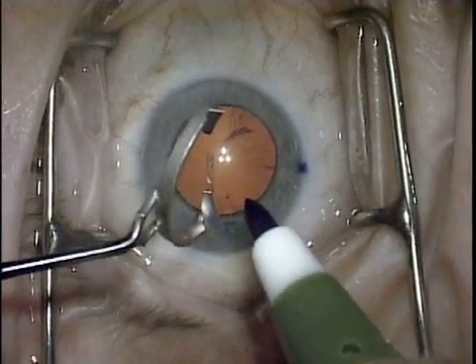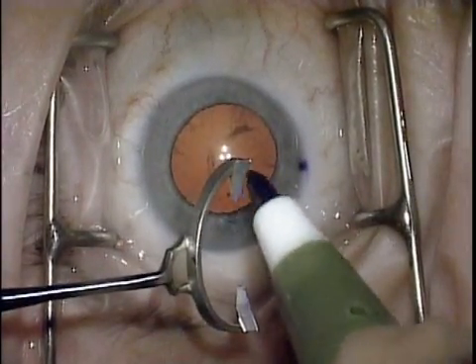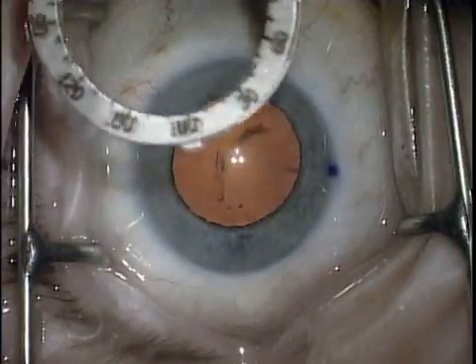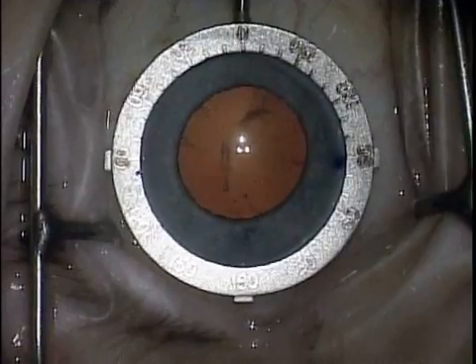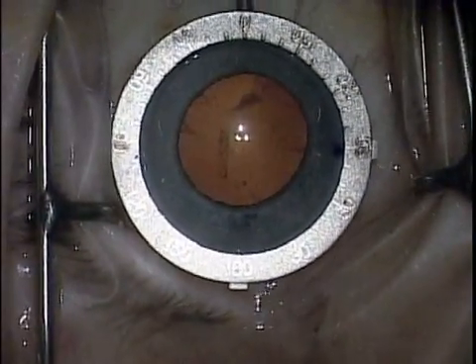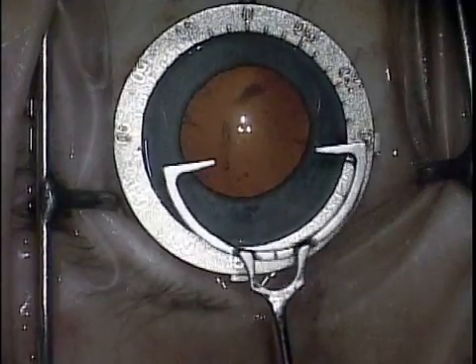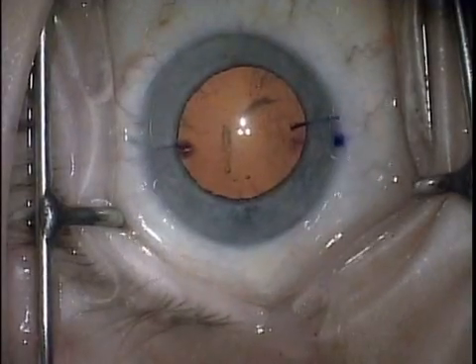In this first case, after inking the half-circle marker, the inferior axis bar is placed directly over the ink dots at 6 o'clock and the degree gauge is centered on the cornea. The half-circle marker is aligned on the indicated plus-cylinder axis and applied to the cornea to create ink marks at each end of a line transecting the center of the cornea.